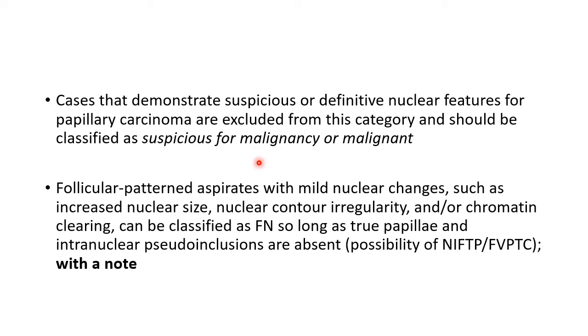Cases that demonstrate suspicious or definitive nuclear features for papillary carcinoma are excluded from this category. So if you have nuclear features of papillary carcinoma, then those cases should not be grouped under FN, but they should be classified as suspicious for malignancy or malignant.